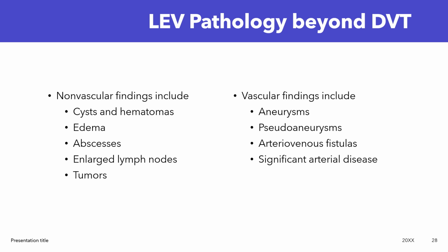hopefully as thrombolytics kick in, they're going to start breaking down and turning more complex until hopefully they ultimately turn into a cystic appearing structure as all of the thrombus is broken down and becomes serous fluid. You can also see a lot of interstitial edema, where you'll see collections of fluid between adipose tissue layers and other areas. You can find abscesses.